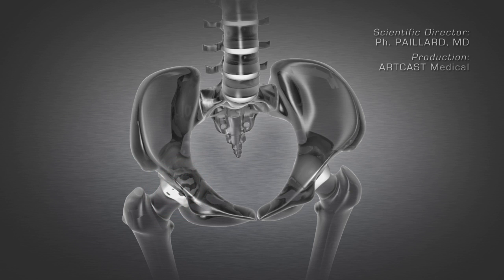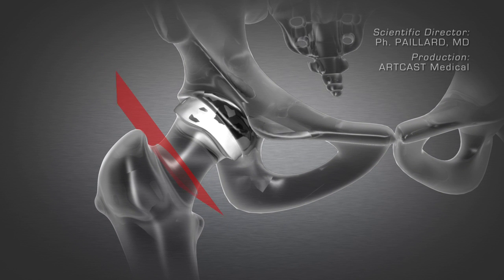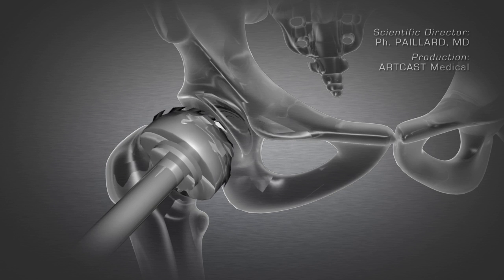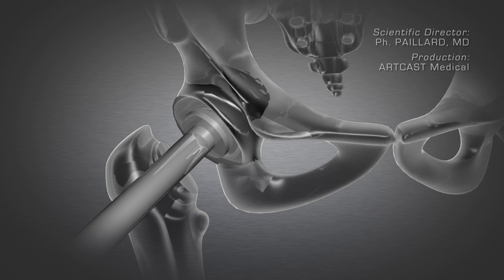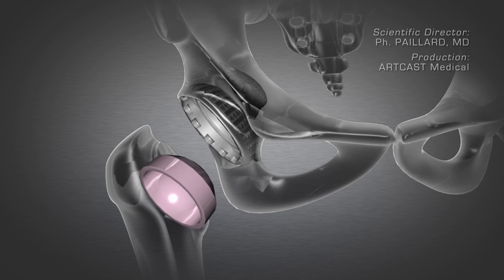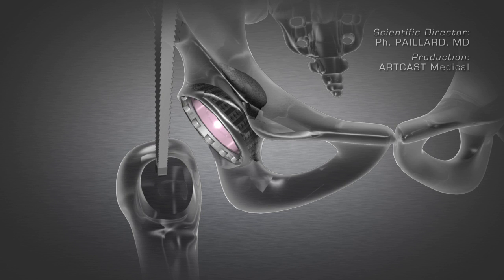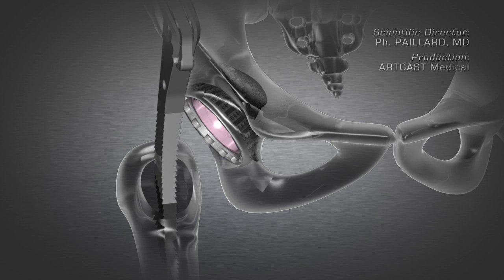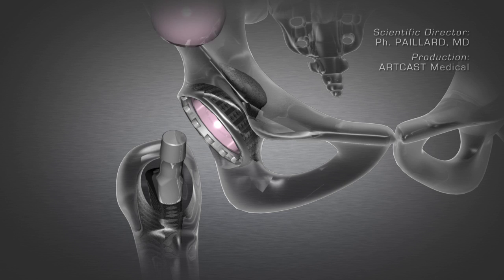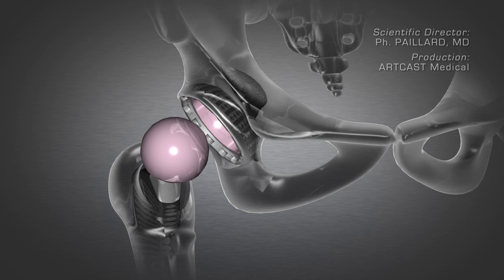A hip prosthesis comprises two main components. To position the first component, the worn femoral head is cut off. The acetabulum is prepared using a motorized cutter for the impaction and integration of the implant in the pelvis. The femur is then prepared using rasps for the insertion of the femoral stem of the correct size. The femoral head is then attached to the stem forming the second component. The hip replacement is complete.